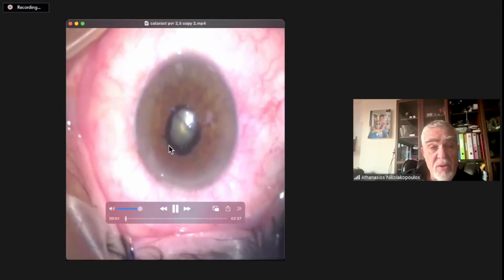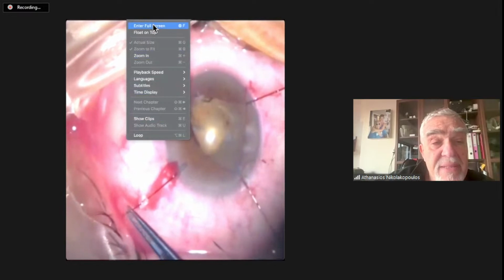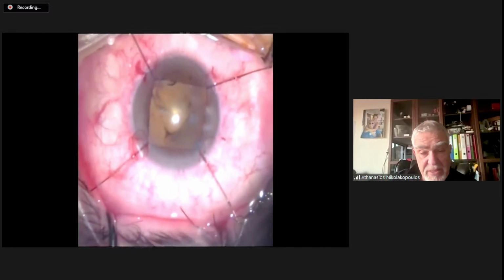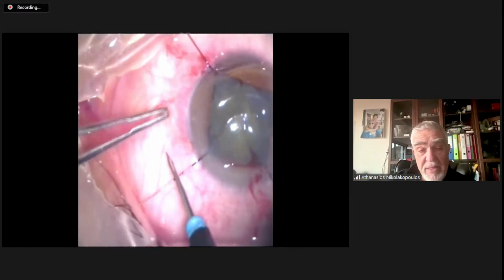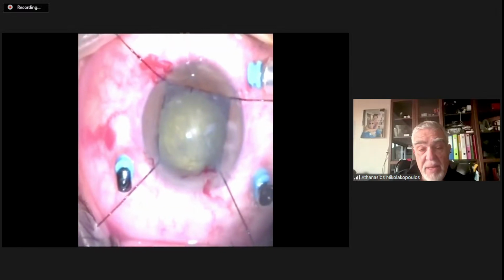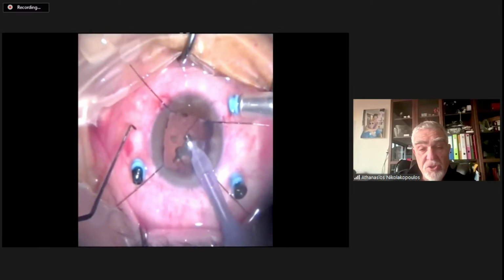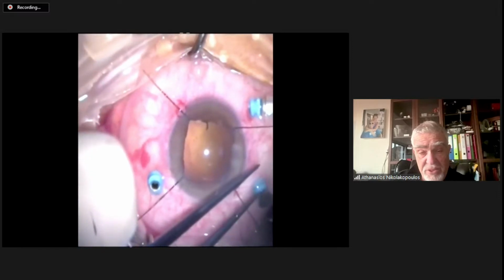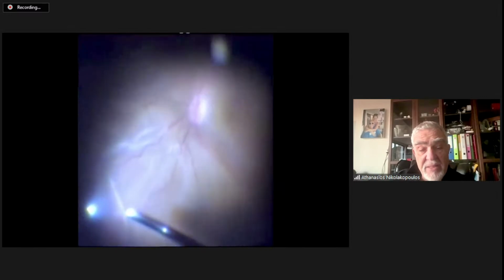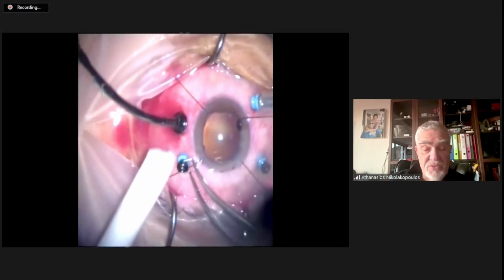And I don't know if I can share it. Let me end the full screen. First of all, we got to see what's going to happen with the cataract. So we just use the iris retractors, and we try to put the 25 gauge trocars. In this case, I'm not using valve trocars because you'll see later. And I'm finishing the phaco surgery while I have implanted all the trocars inside the eye first. And then I have to see what's going on with the retina. And then you can see there's a PVR in the retina, that's normal. And then I put a light because I need 2 hands for that.